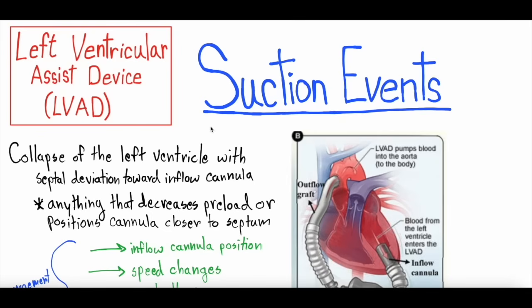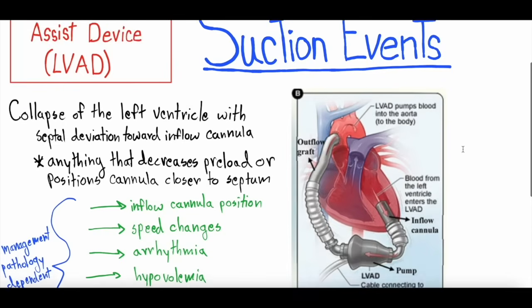Today we're going to be doing our third video of our LVAD series, our left ventricular assist device series. And today we're going to be talking specifically about suction events. What is a suction event? What causes it? How can we evaluate for that cause? And what can we do to fix it? So, suction events with left ventricular assist devices.